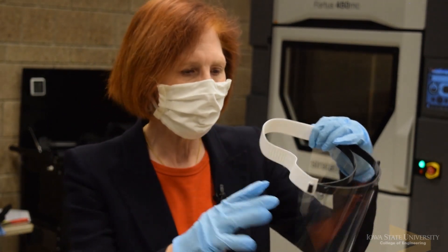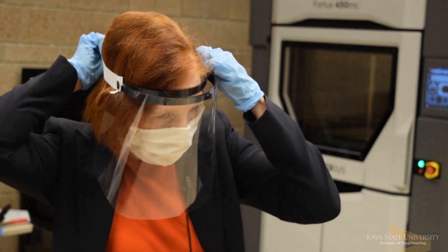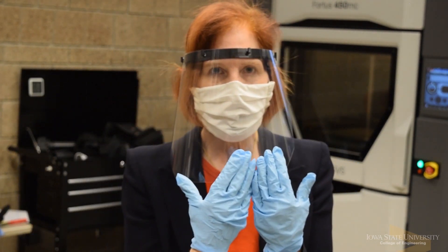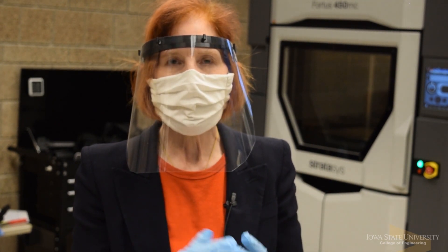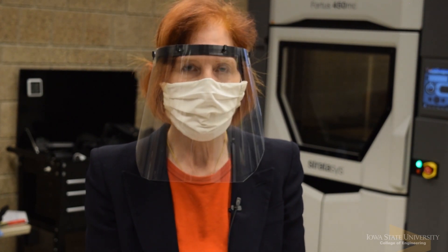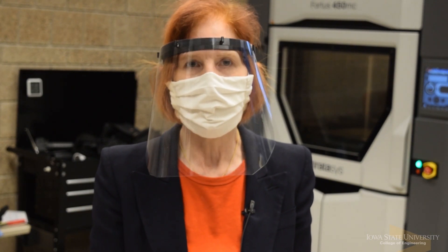How they're going to do it in the final design may differ from this, but this is just to give you an idea. You put it over your head like this and it protects your mask. What I'm wearing is not an N95 mask like the doctors and nurses would be wearing — it's just a homemade cotton face mask — but it gives you the idea of how it would work.